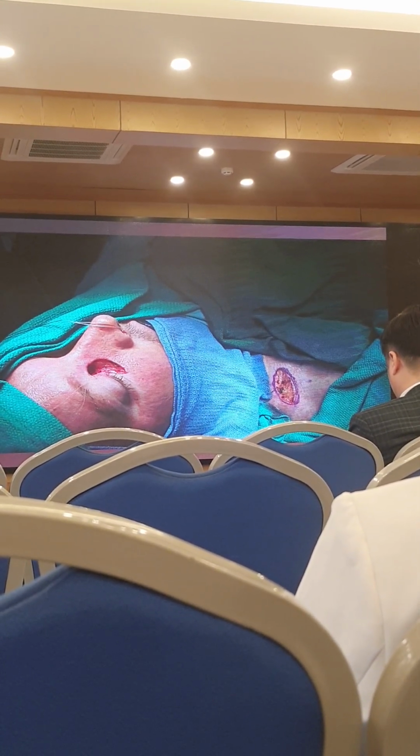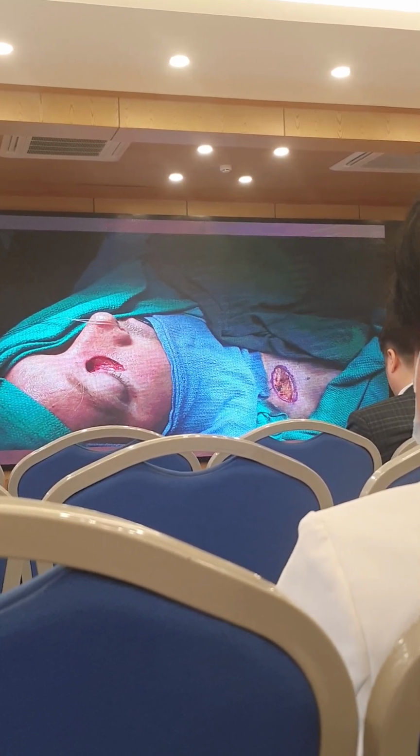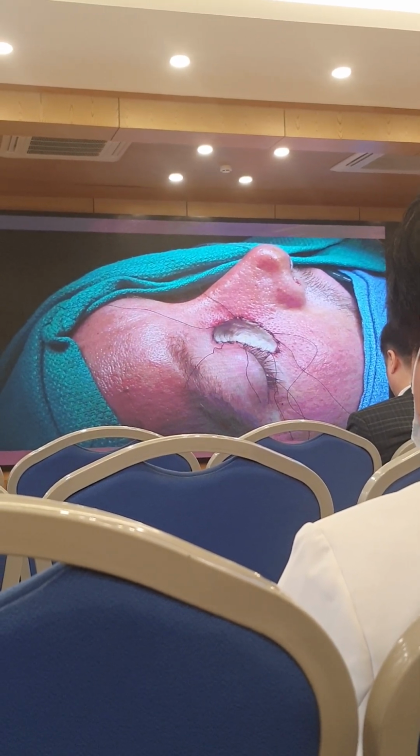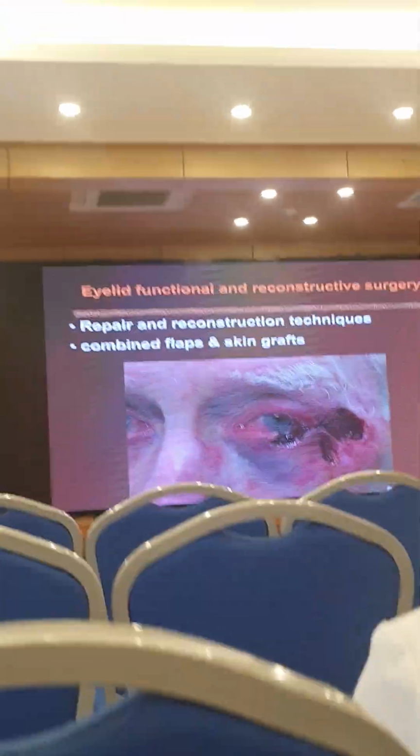so you can take it from behind the ear, retroauricular, or above the collarbone, supraclavicular. So we took a supraclavicular skin graft and sewed that into place. Now, supraclavicular skin is a little thicker than upper lid skin, but it works very nicely as a skin source for periorbital, periocular skin grafts.